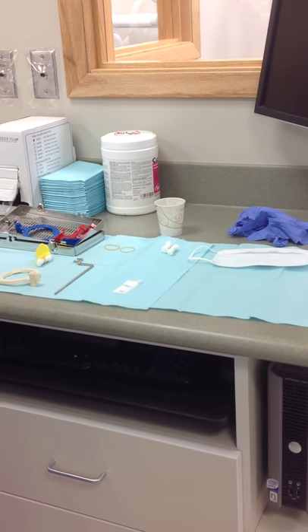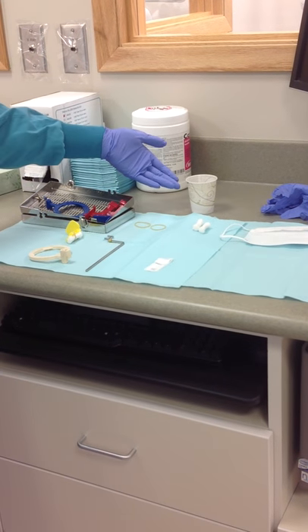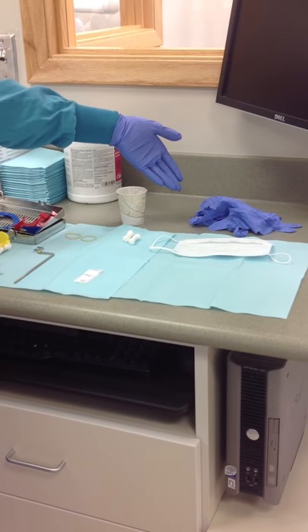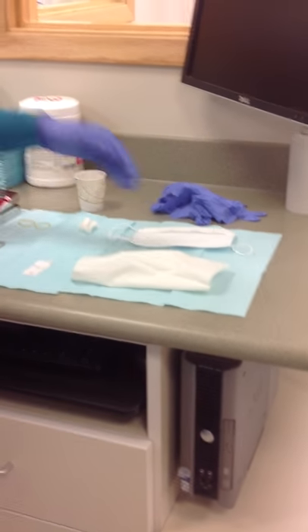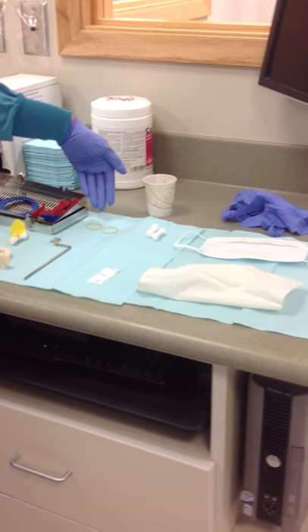To prepare the unit, you will need two blue napkins, a Dixie cup, a size 2 film, a cassette, a few sets of gloves, a Kleenex to wipe off the phosphor plates, tabs, cotton rolls, bumper bands, and a mask as optional.